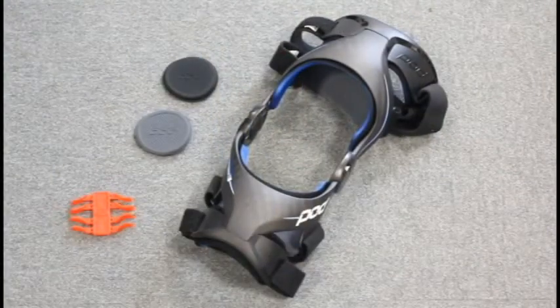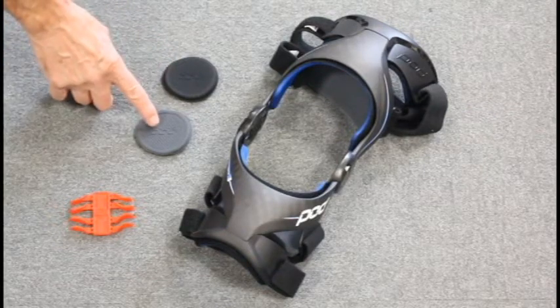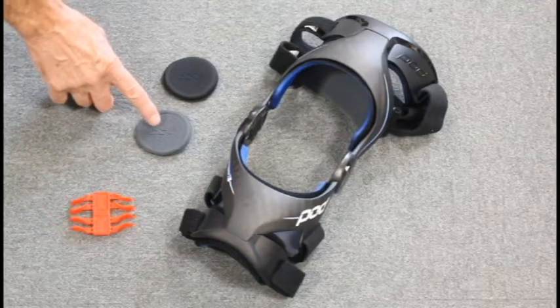The POD Knee Brace also comes with a fitting kit which includes a thick and a thinner spacer. It also includes a flexion reduction kit.